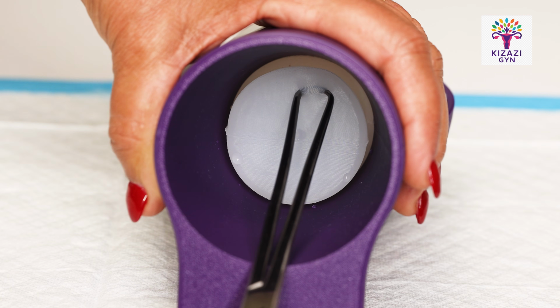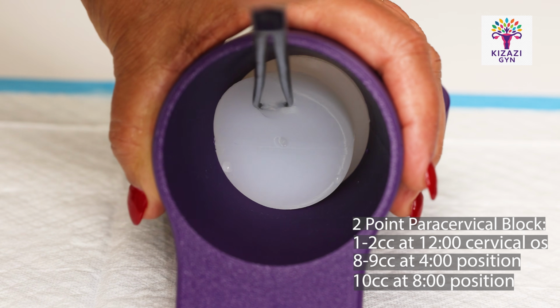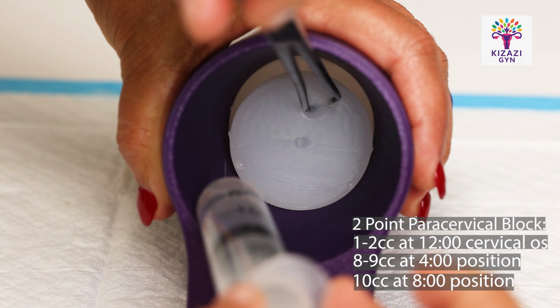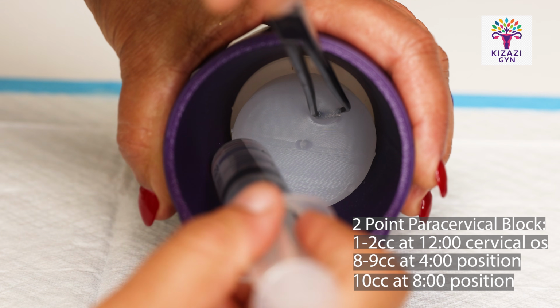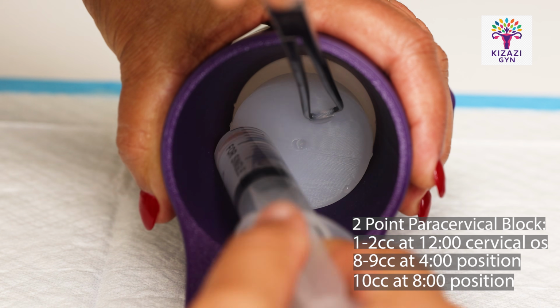Let's practice the 2-point paracervical block using the advanced cervix. As you see here, you really do have to use the tenaculum to manipulate the cervix around. So here, we're going to use the tenaculum to move the cervix to the side. We're going to inject at the 8 o'clock position, 1 to 3 centimeters.